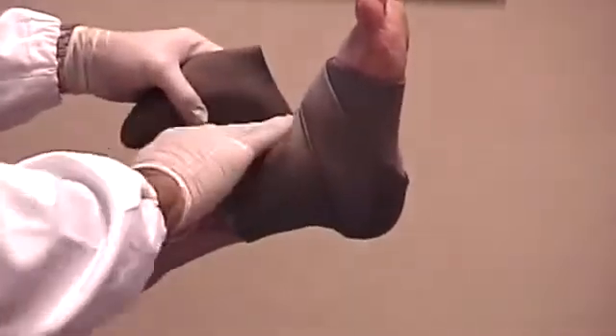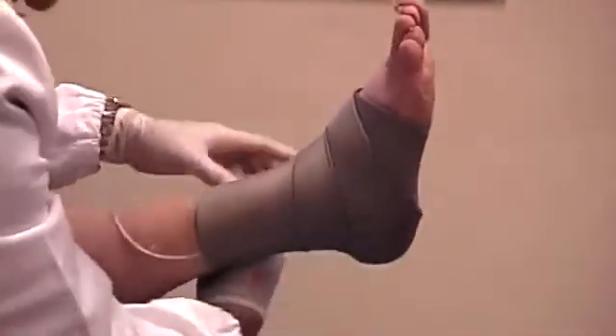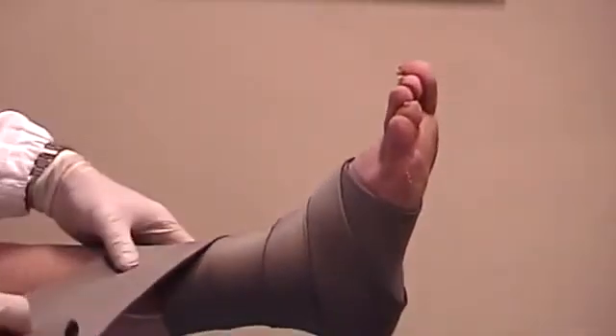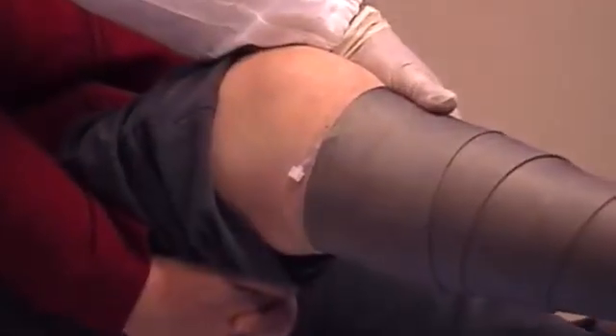In this specific case, we can see an application being carried out with the special TerraBond bandage, with a high bacteriological barrier composed of copper-plated nylon 3D tissue with silver fiber. The catheter remains on the outside for subsequent infusions.